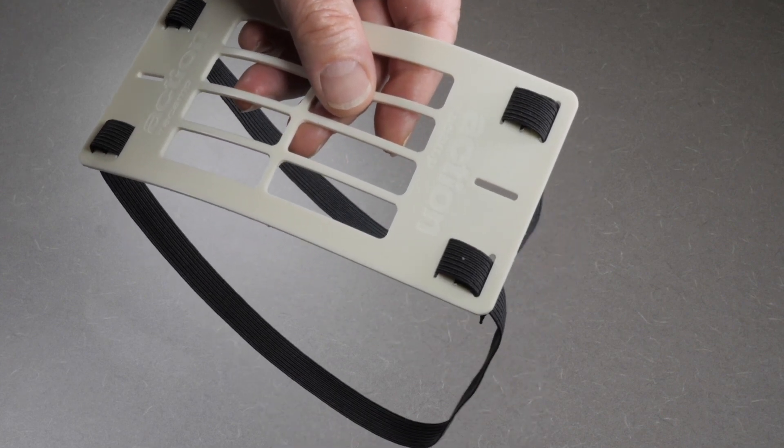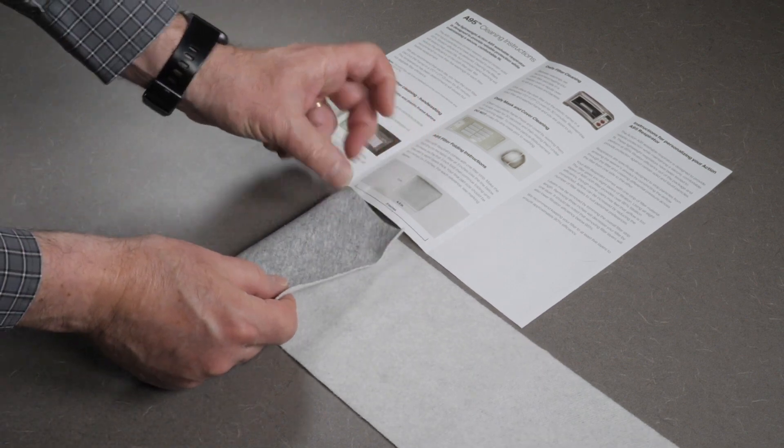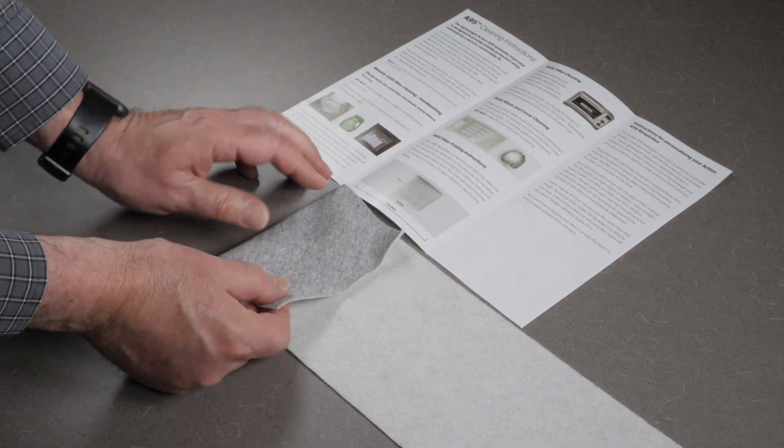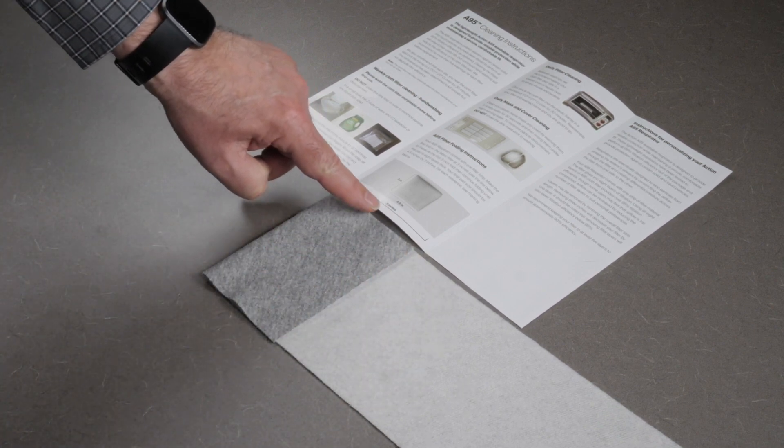Folding your filter isn't difficult, it just takes some practice. You were given at least 27 inches of filter material in your kit. After a lot of testing, we found that the first fold should be three inches.